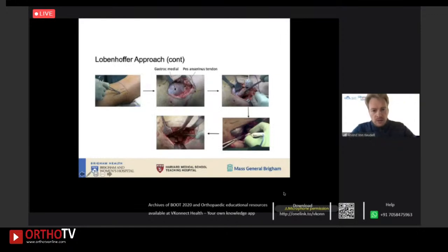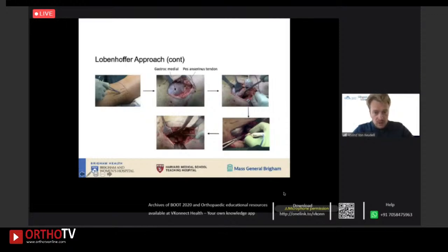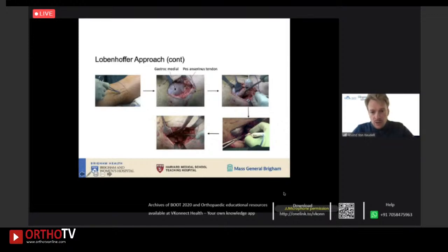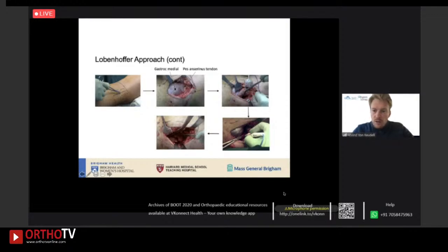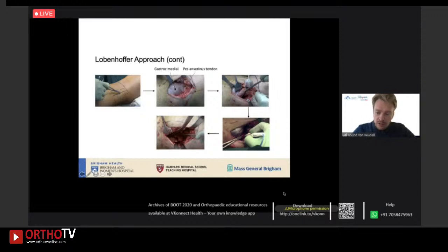Clinical pictures show the patient in the prone position. Mark out your incision, dissect down through the subcutaneous tissue, identify the fascia of the gastrocnemius and the neurovascular plane, which comes in a reverse orientation as you are lying prone. Then you lift off the entire medial head of the gastroc off the posterior aspect of the tibia, then incise the popliteus muscle and clear out the fracture.